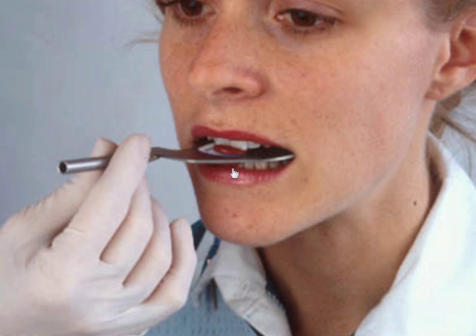At this point, we could use bite tabs on the bottom side of the bite fork to have the patient bite up to help hold that bite fork against the upper teeth, or we can put cotton rolls on either side to have the patient bite against the cotton rolls to help hold the bite fork against the upper teeth. Or we also have a bite fork stabilizer, which is a horseshoe-shaped sponge material that you can peel and stick into place to have the patient bite against to help hold that bite fork against the upper teeth, capturing the plane of occlusion of this patient.